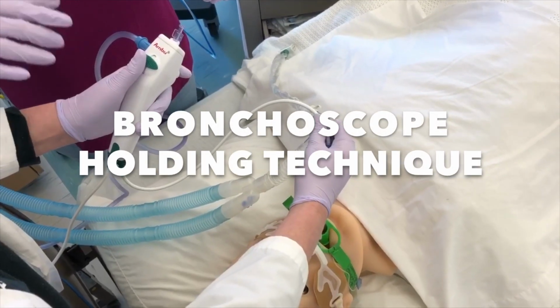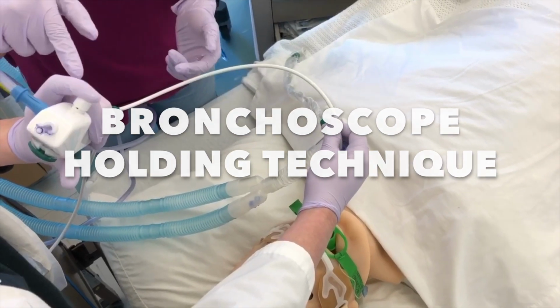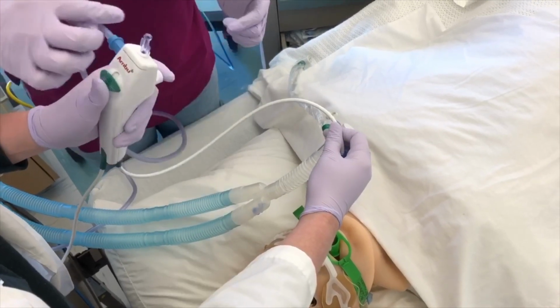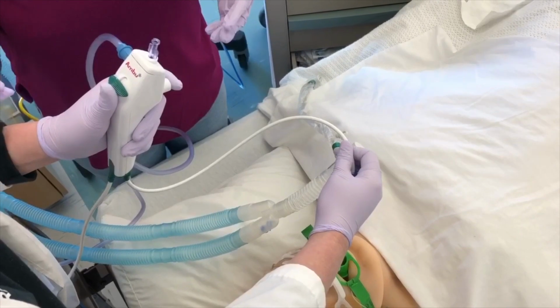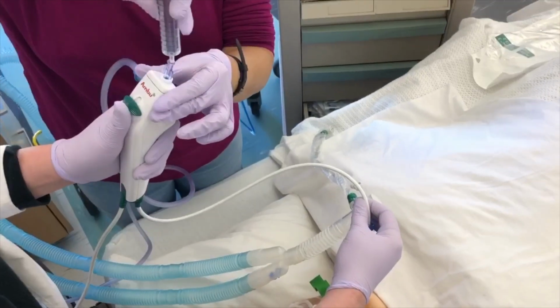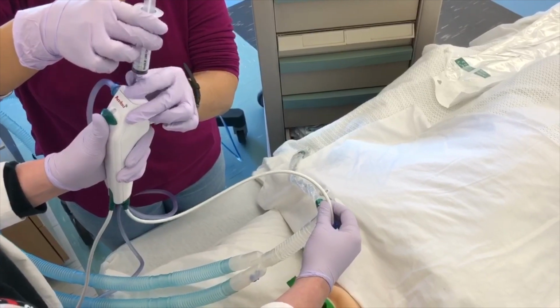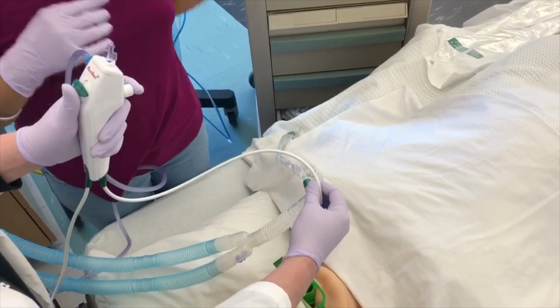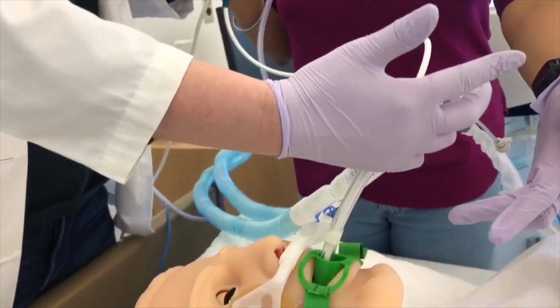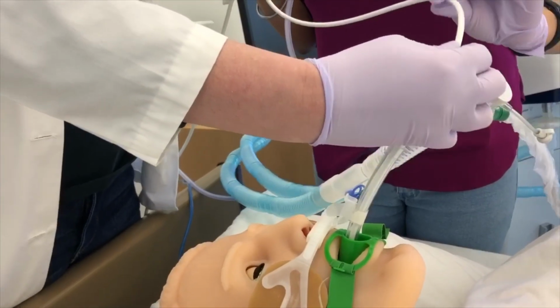As I mentioned earlier, the physician will hold the scope in the non-dominant hand with the thumb on the toggle and the index finger on the suction pressure. The suction tubing is attached to this port, and this is the insertion port. So when the physician asks for any sterile water or drug, we insert the syringe and instill saline, and the physician stabilizes the ET tube with the dominant hand, with the pinky below the tube, and the index finger and thumb are used in inserting the bronchoscope.